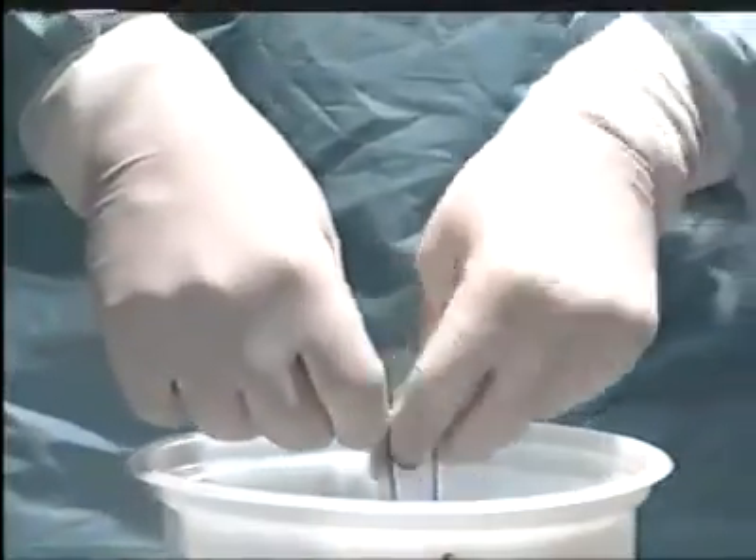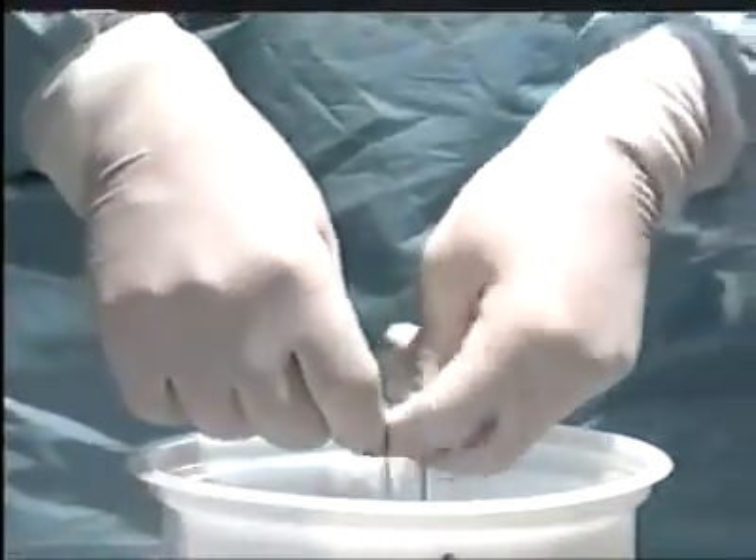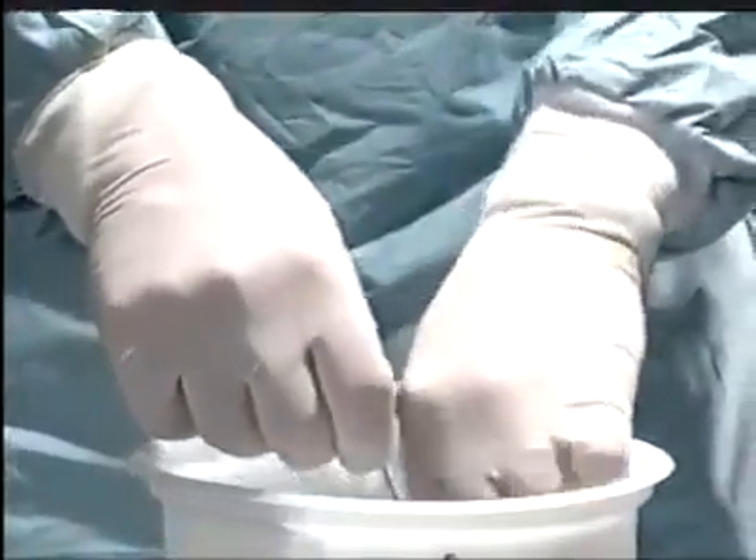Then tie a further throw outside the body, snugging it down with the index finger and tightening it by counter-traction against the finger. Do a third throw for security and snug it down.